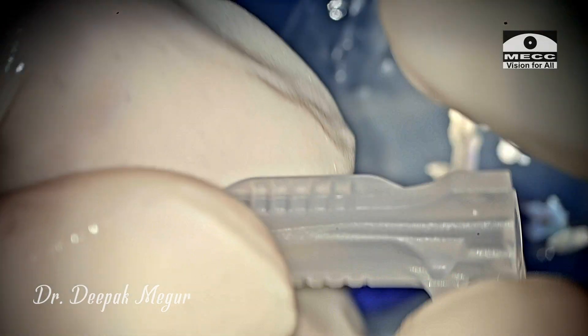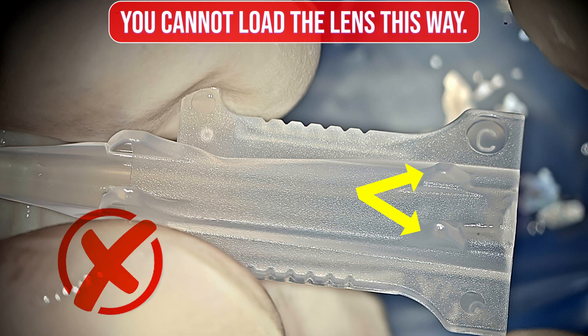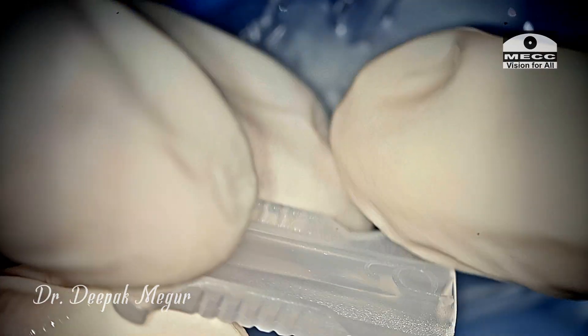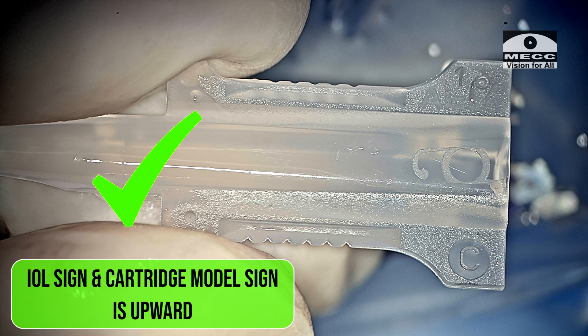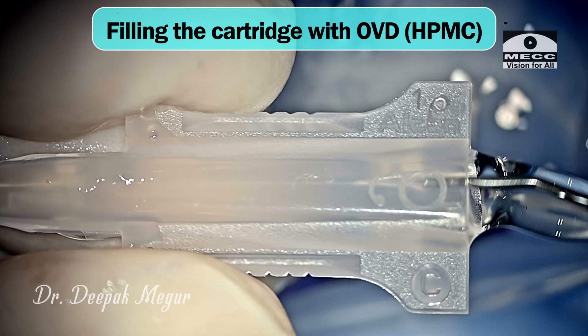When we flip it across you can see these two knobs, and this is not the right orientation. So before loading the lens, ensure that you're holding the cartridge the right way up. The cartridge is filled with OVD — that is HPMC — which is what I'm using now.